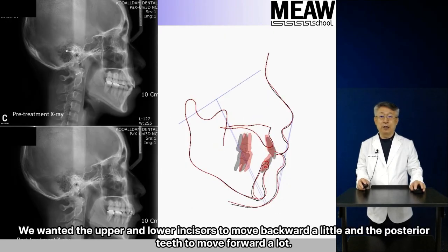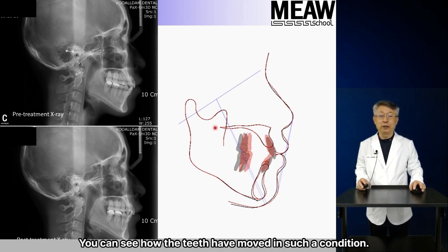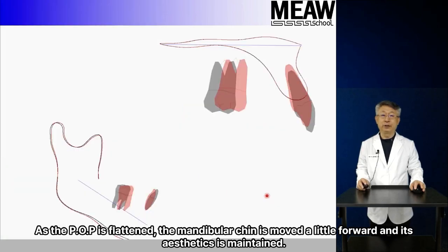We wanted the upper and lower incisors to move backward a little, and the posterior teeth to move forward a lot. To do this, the second premolars of upper and lower were extracted. You can see how the teeth have moved in such a condition. As the POP is flattened, the mandibular chin is moved a little forward and its aesthetics is maintained.